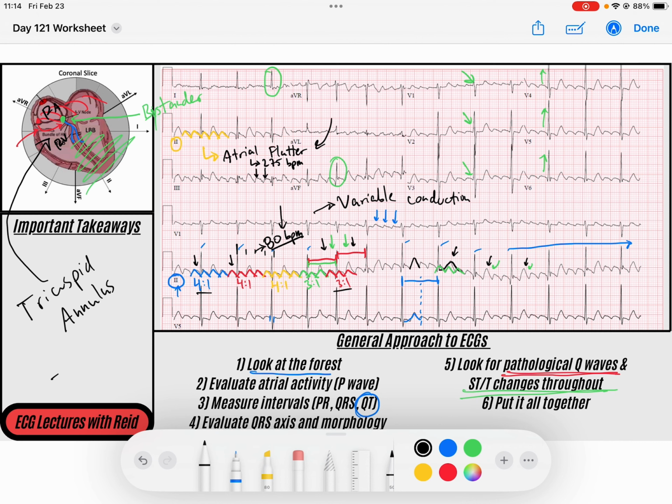So what could those be? We could say any chronic pulmonary disease, left-sided heart failure that leads to right-sided heart failure, right? So just kind of fun little ideas to think through, right, when you're talking to your patients about maybe what their risk factors are, right? And maybe it helps you with your workup of nuanced A flutter.